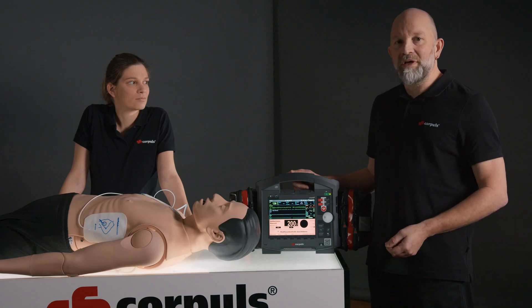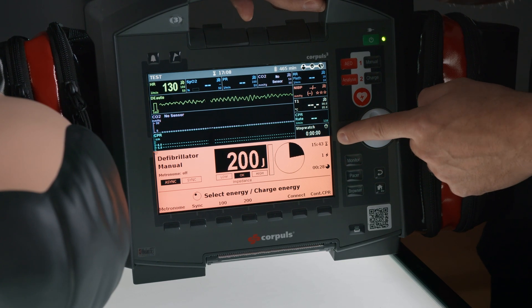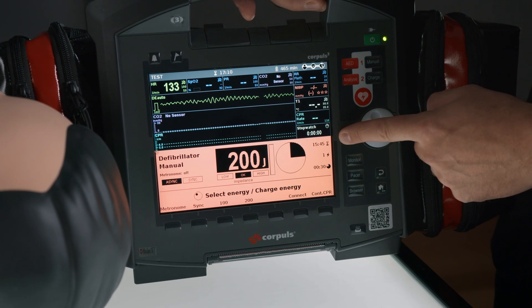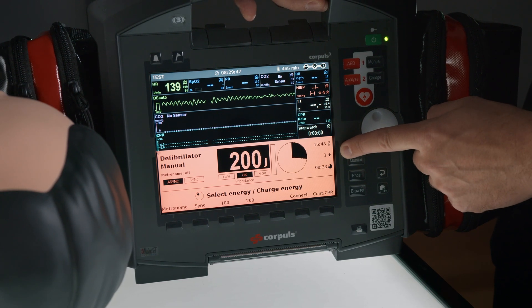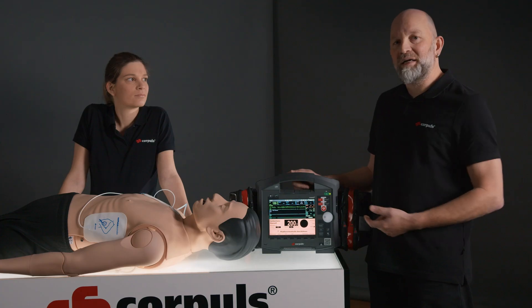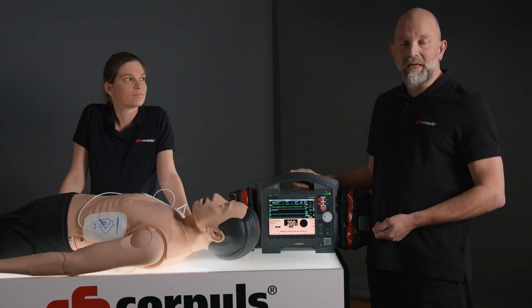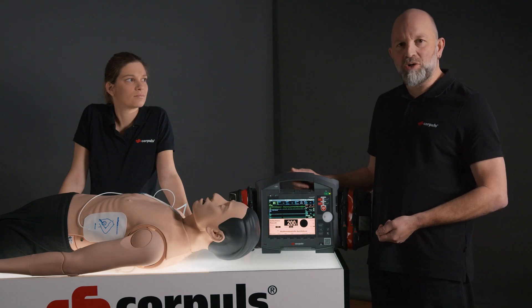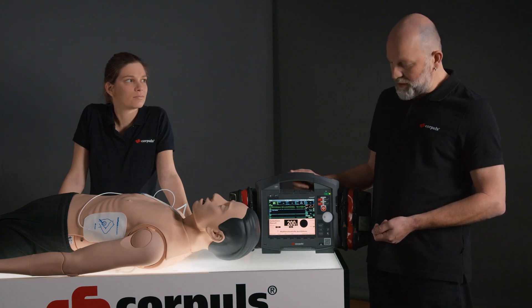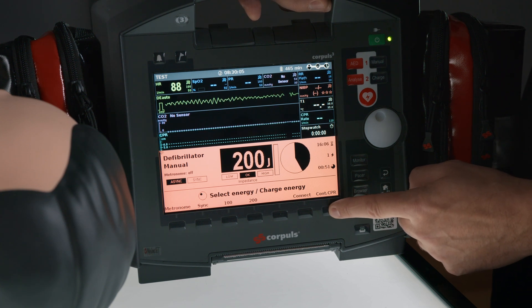From the red therapy field we can gather additional information. On the top right we can see the total time since the therapy started; below that is the number of shocks delivered; and the small pie chart shows the time elapsed since the last analysis. If an analysis shows that no shock is recommended, we can restart the pie chart using the soft key, then continue CPR.